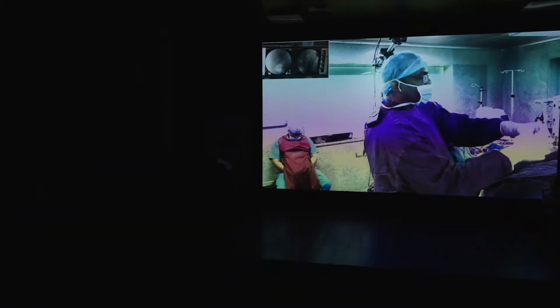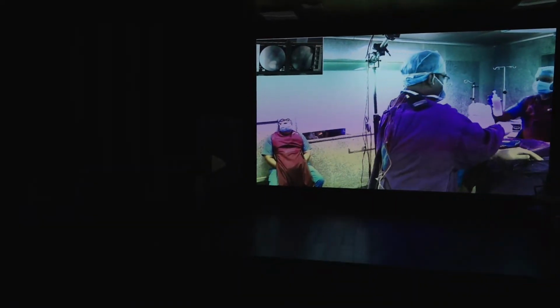A few things. How many of you are comfortable with fluoroscopy and fluoroscopy guided interventions? Fine. Good. So for the rest of you, with fluoroscopy, things are slightly different from ultrasound. With fluoroscopy, bone is our friend.